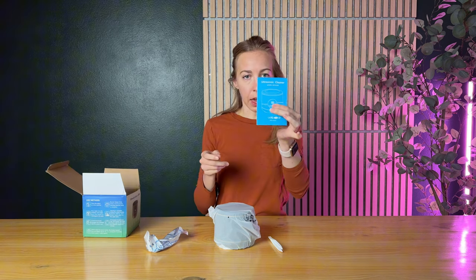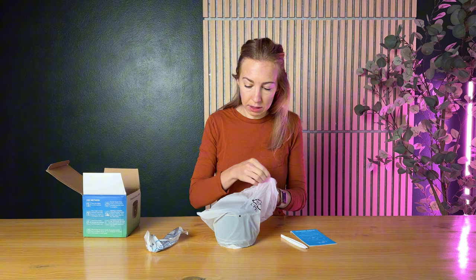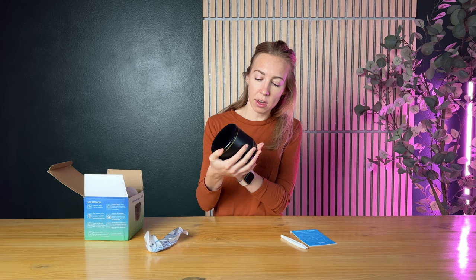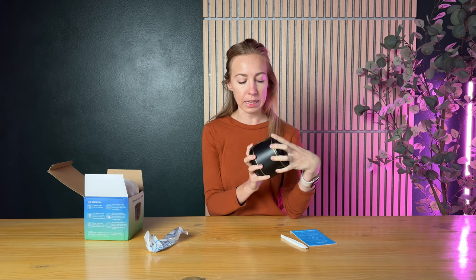So it comes with a set of instructions and these tweezers — you can easily pull small things out like jewelry if you need to. Here is the unit itself. It is actually very compact and really lightweight, like barely anything to it. I think it looks nice. The black and gold just make it look a touch classier. If you're going to put it in your bathroom, it's not going to be like this weird, ugly thing. So it looks really nice.